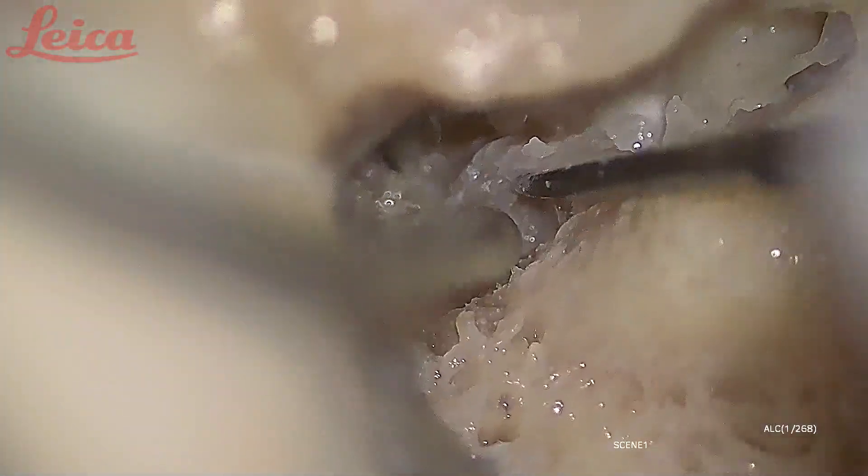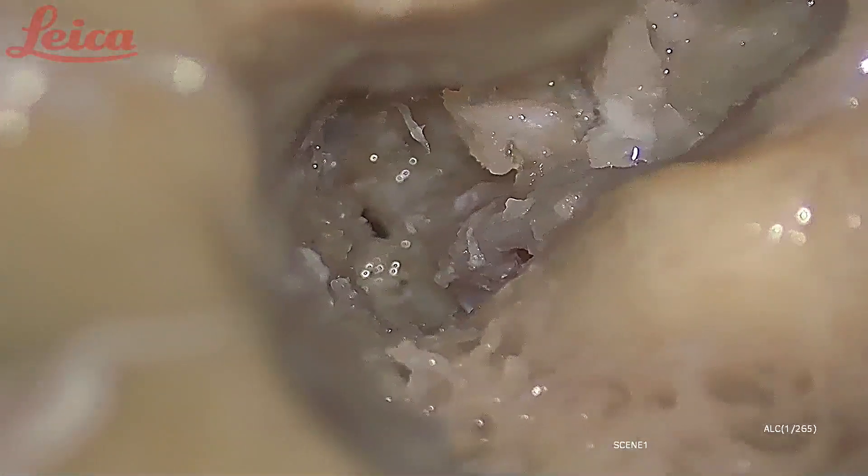Now you can very clearly see — this is the first genu, and what you see going down is the labyrinthine segment. The labyrinthine segment is the shortest and the narrowest segment, as was mentioned. I have lifted up the nerve here — what you are seeing is the labyrinthine segment. My instrument is near the first genu where the nerve is taking a turn. This is the geniculate ganglion.